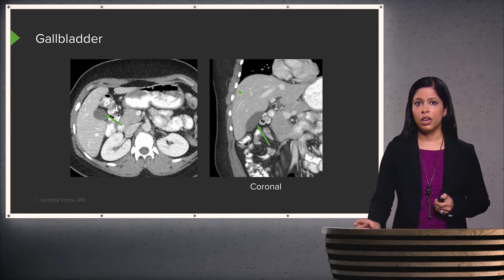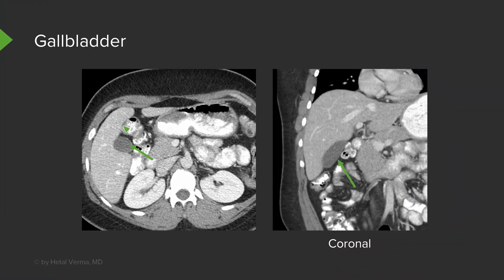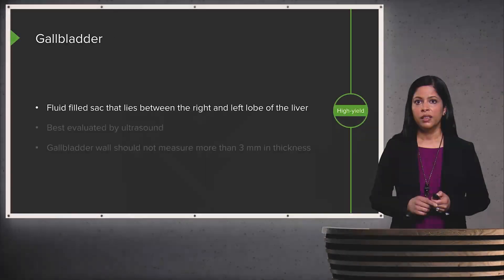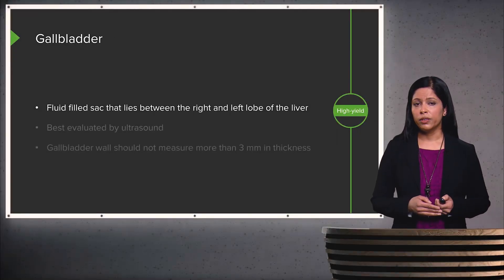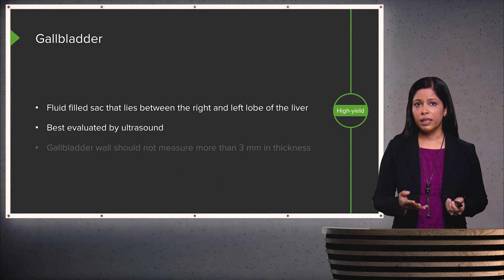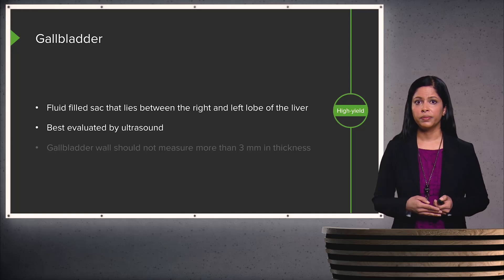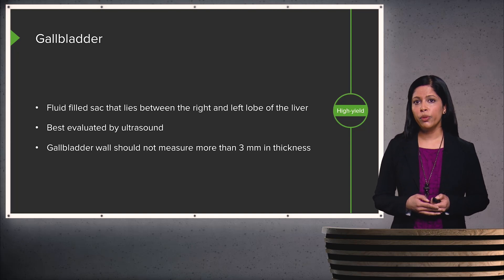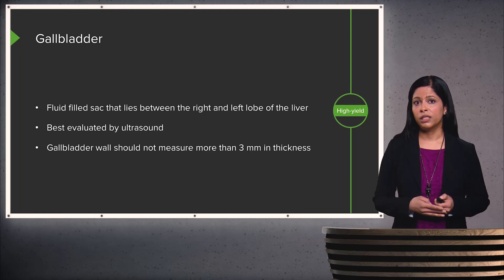The gallbladder is embedded underneath the liver but is well seen on CT as a fluid-filled sac. It's located between the right and left lobes of the liver and is best evaluated by ultrasound. If an abnormality is suspected, abdominal ultrasound is the first-line imaging modality. The gallbladder wall should not measure more than about 3 millimeters in thickness, which is best assessed on ultrasound but may be suspected on CT.